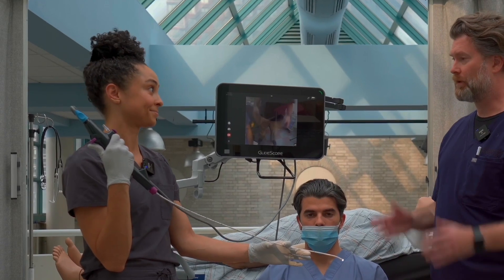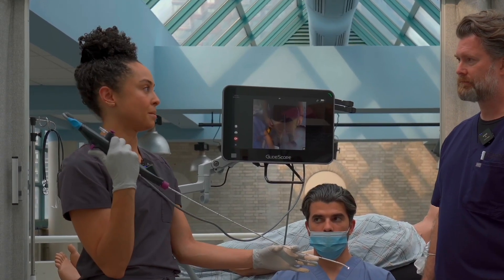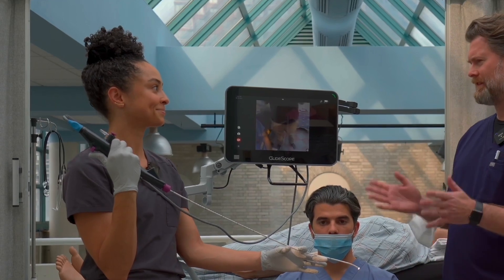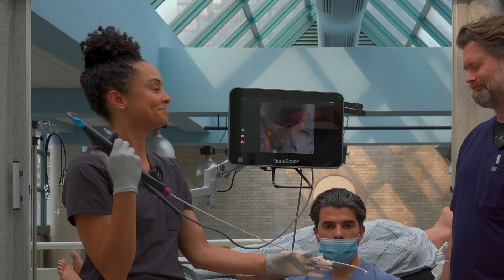What technique do you use? In this particular circumstance I'm going to do the thumb drive. Yeah, I think most of us in the ER are comfortable with the thumb drive and less comfortable with the finger drive. Makes sense.